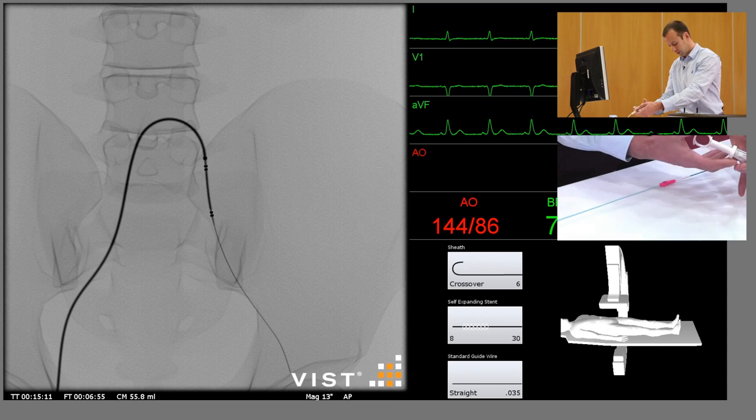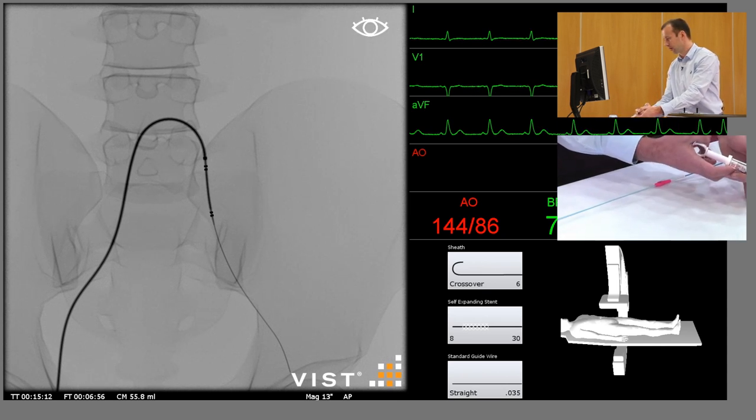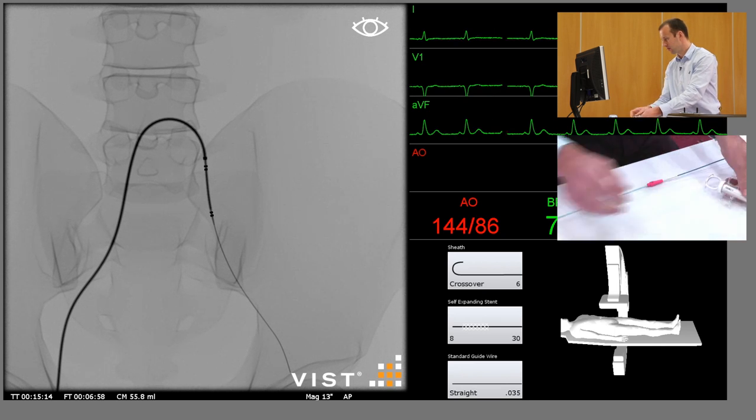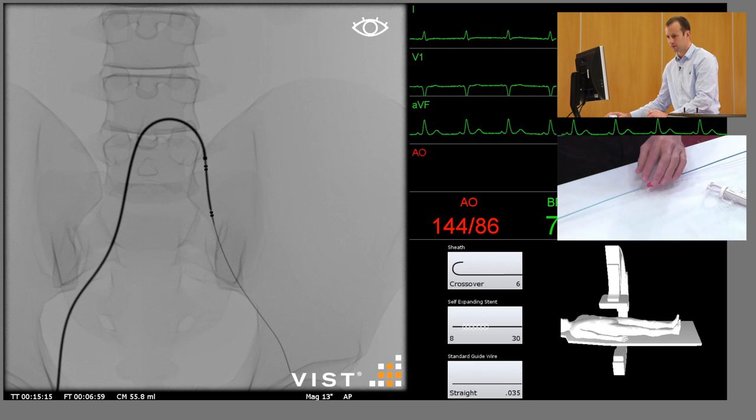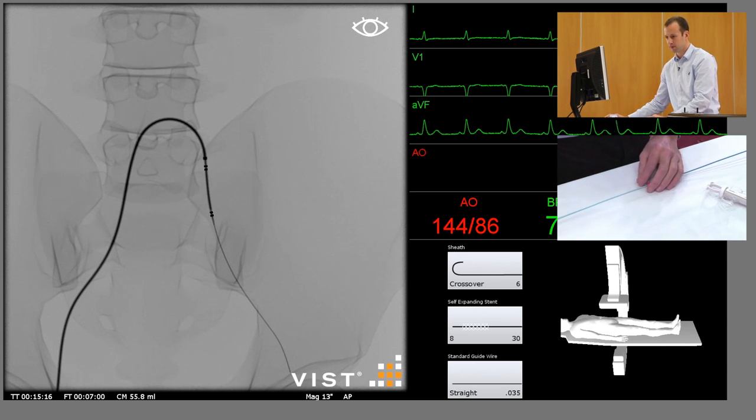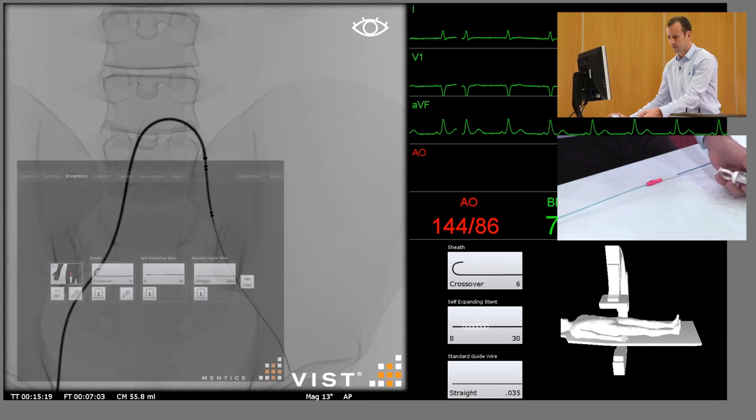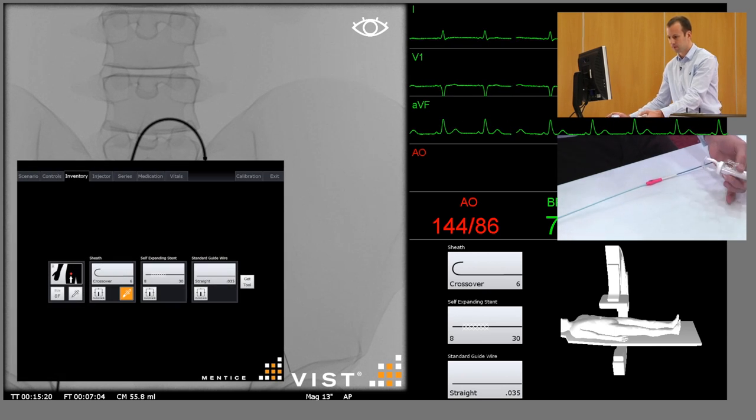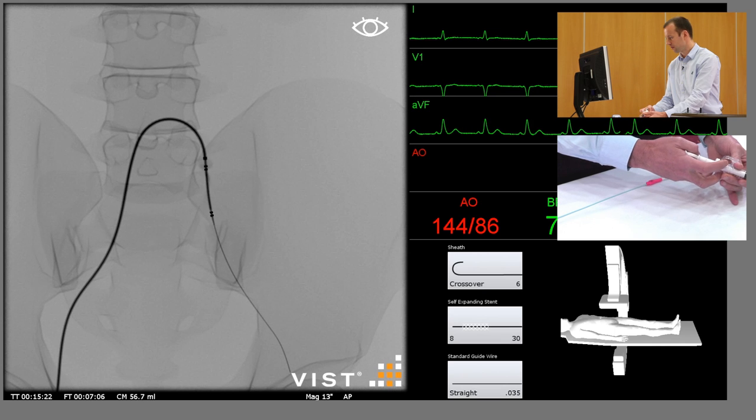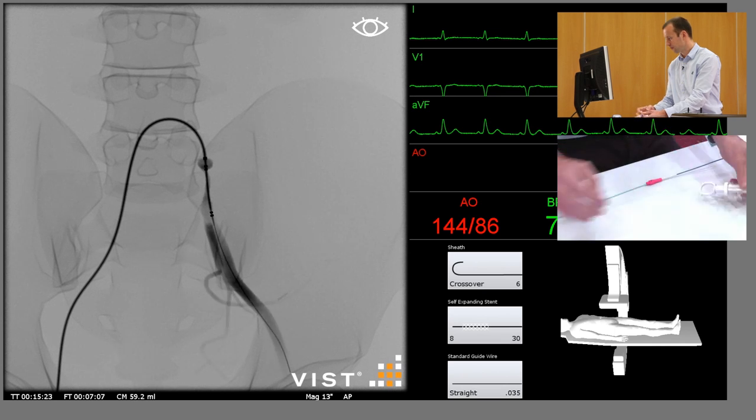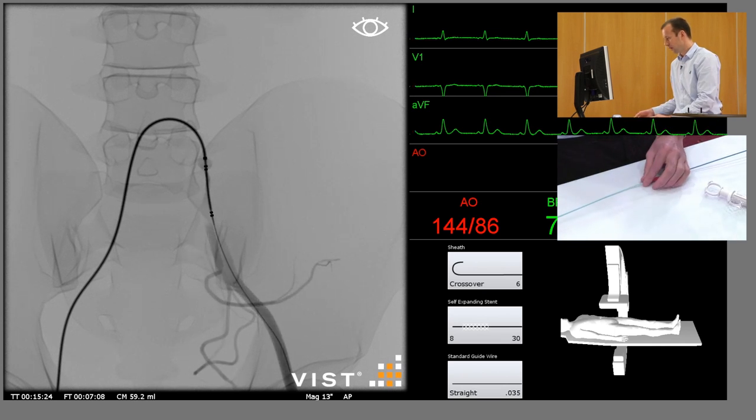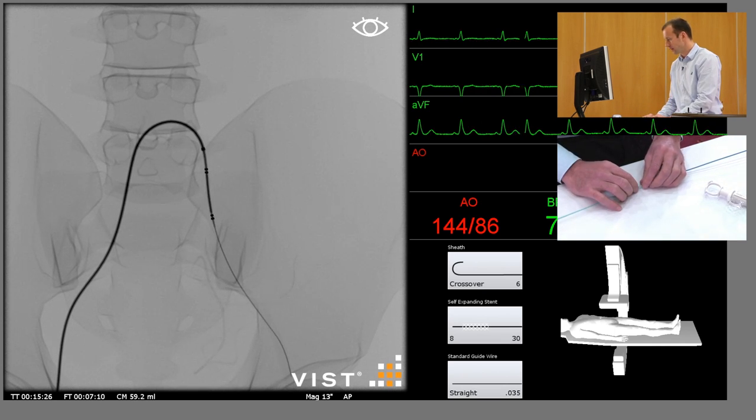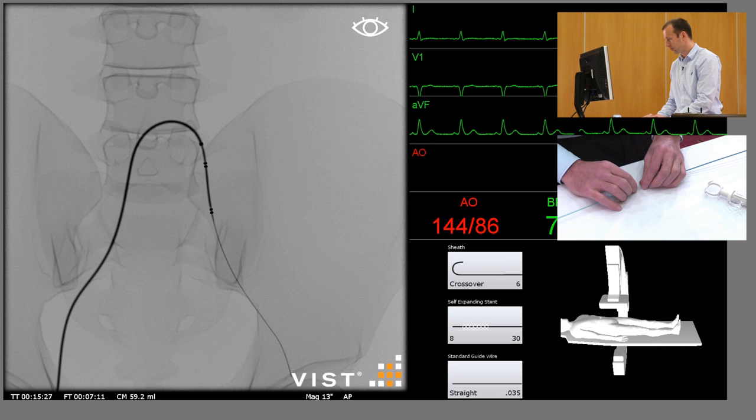I'll just put a little bit of contrast in to help us identify the lesion. The sheath needs to come back a little bit.